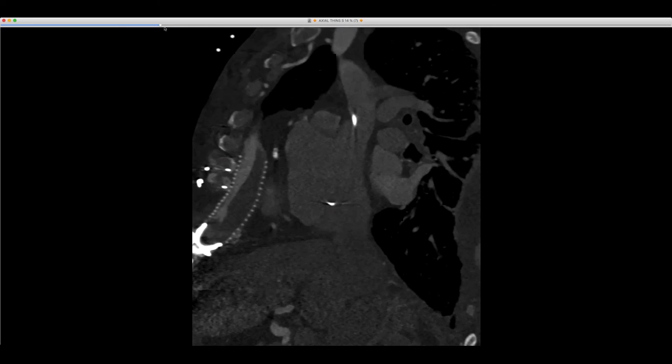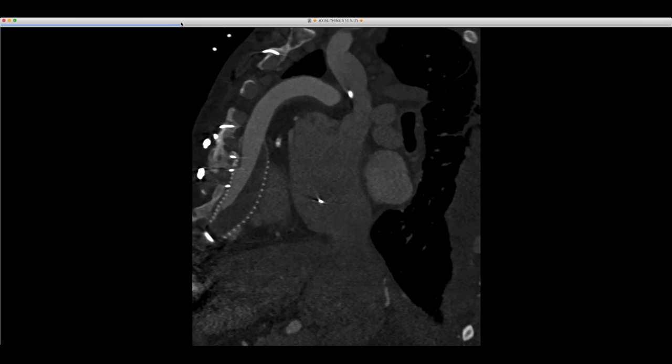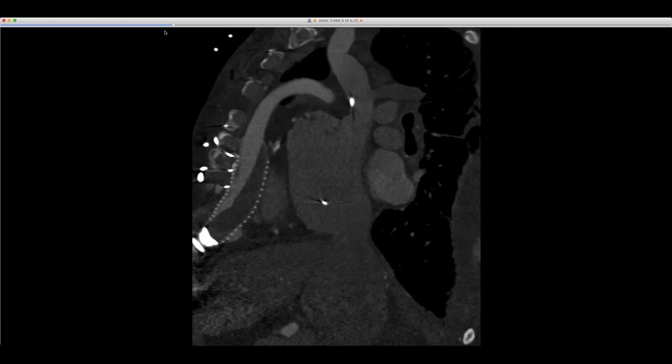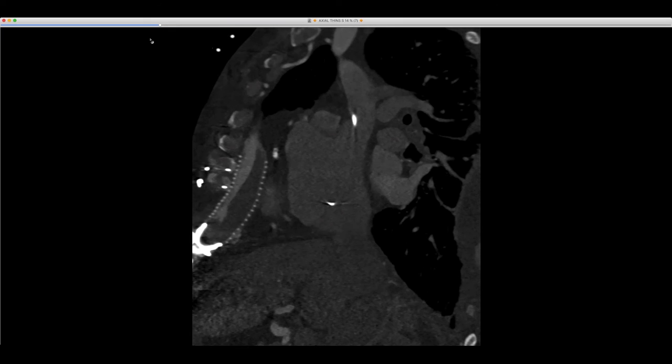Yeah, that sagittal is very interesting. Brent, what is the material that the wrap is made of? Is it Dacron or is it plastic or what? I think it's a form of Dacron. I'm not sure actually, I should know, but it's obviously some material like Dacron. Okay. But anyway, those are my cases for this week. Very interesting. Thanks.